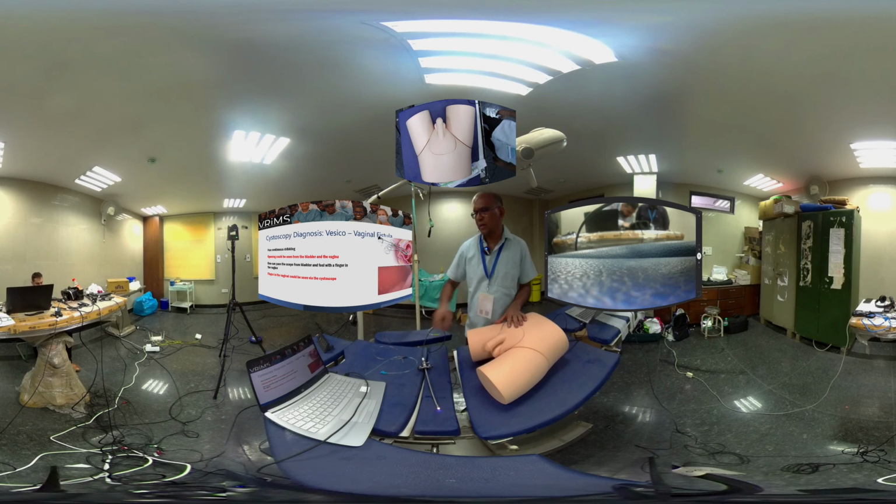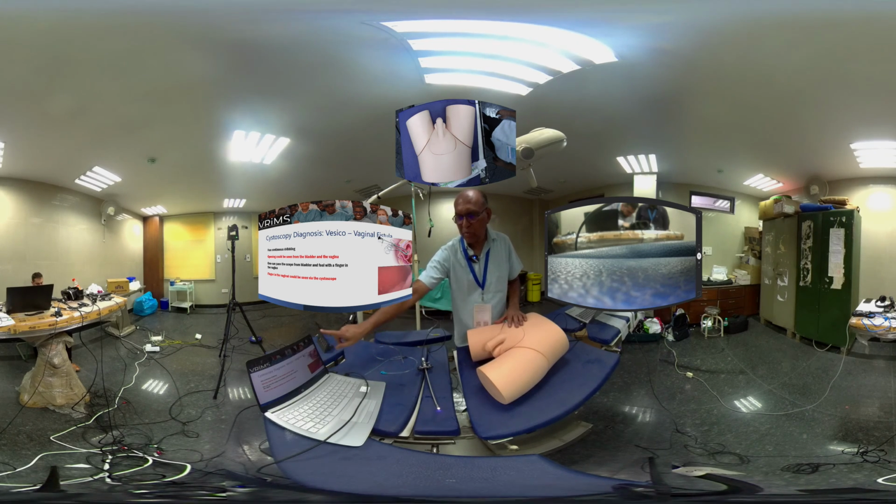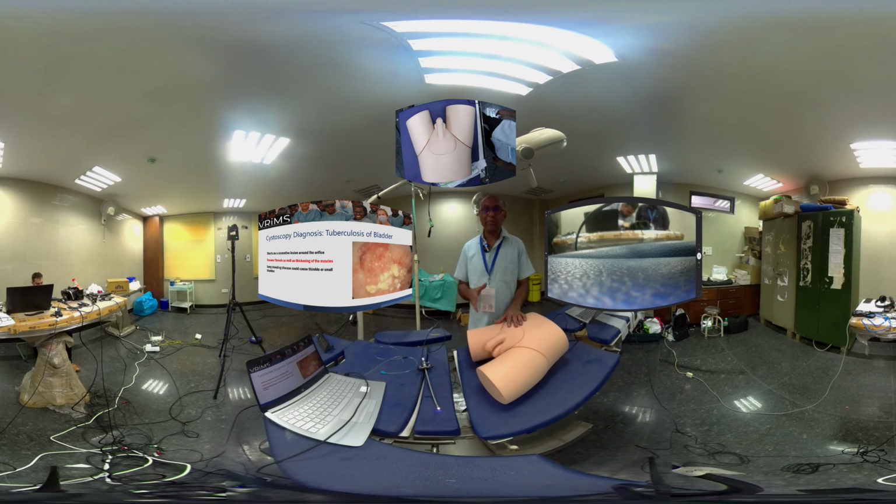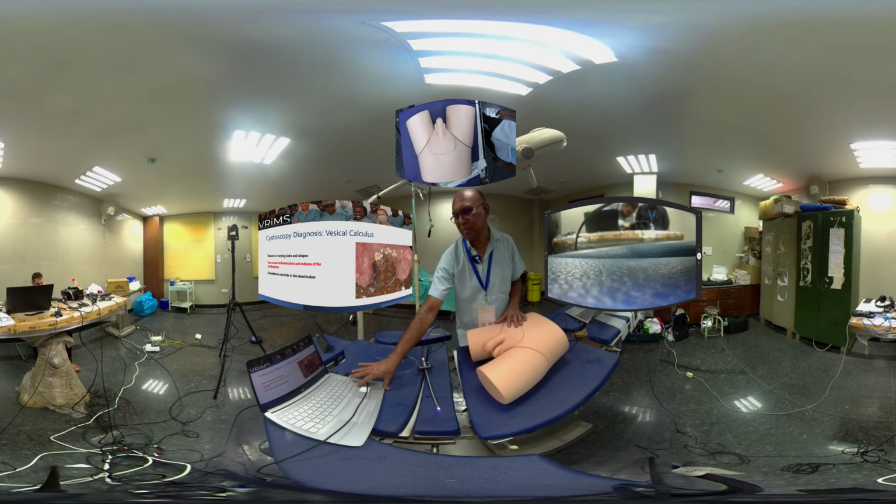And here actually you can see a vesicovaginal fistula. You may be able to come through the vagina into the bladder also to have a look at it. And these are tuberculosis. TB can actually mimic almost anything. People have mistaken it for malignancies and a lot of other conditions. But this is one other way in which TB appears. And this is not an uncommon way a vesical calculus looks.